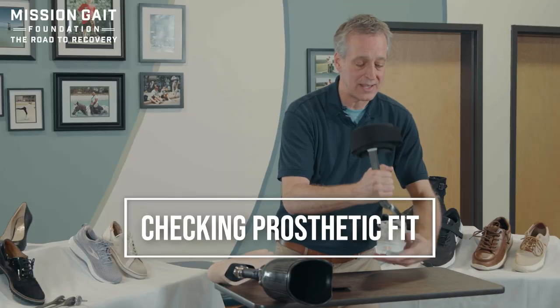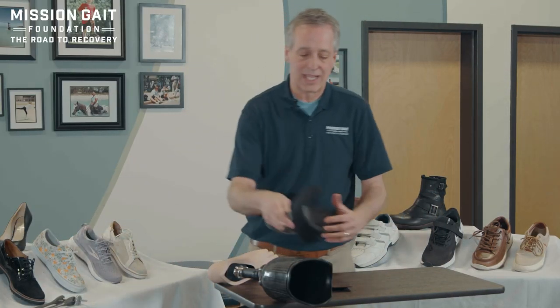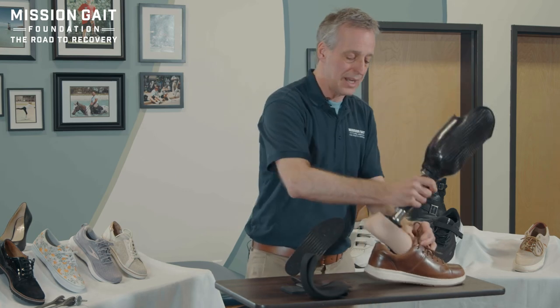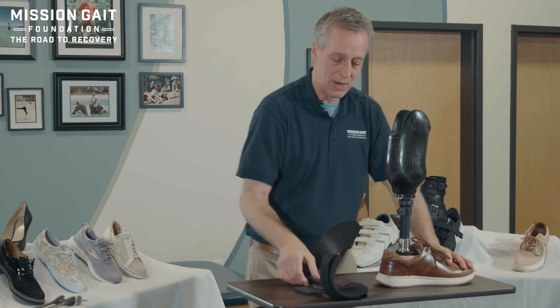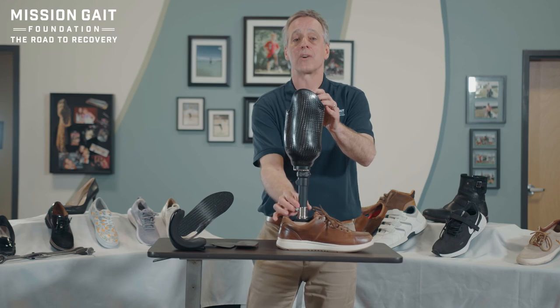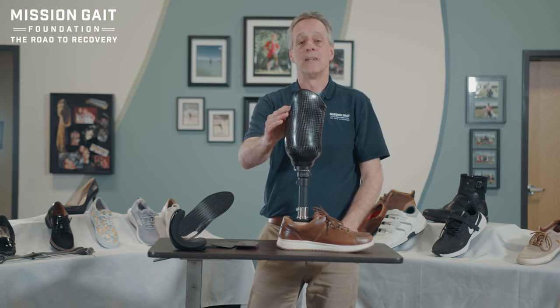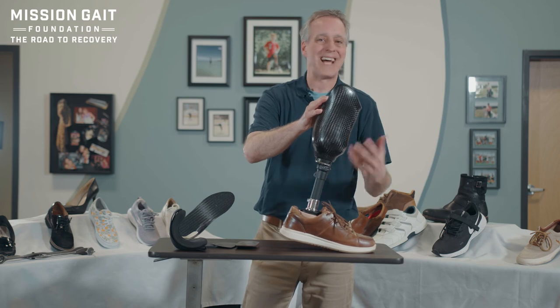The same thinking applies to prosthetics. Take a shoe, slide in the prosthetic foot, and check: is the pylon vertical? If the shoe is on a stand and the pylon looks just about vertical, you're fine. If it's leaning back, you may need wedging. If it's leaning way forward, that's a shoe you can't wear.